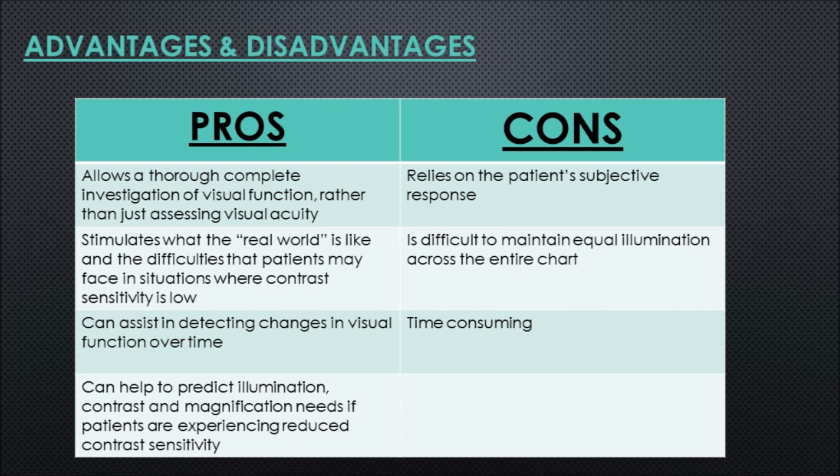The pros of contrast sensitivity testing. It allows a thorough, complete investigation of visual function rather than just assessing visual acuity. This may assist in detecting visual problems at an earlier stage.